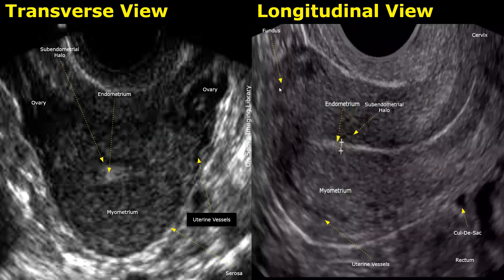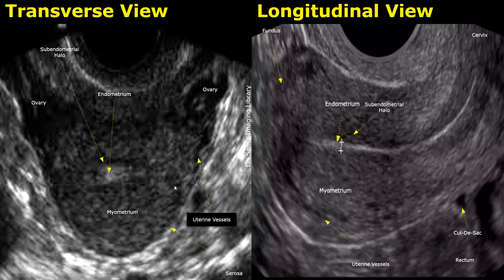Now we will look at transvaginal images of the uterus and ovaries. Transvaginal images provide much better detail than transabdominal images. This image is in the transverse plane, showing the uterus in cross-section with parts of the ovaries seen on the sides. We can see the echogenic endometrium with the hypoechoic subendometrial halo around it. The hypoechoic tubular structures in the myometrium are uterine vessels.